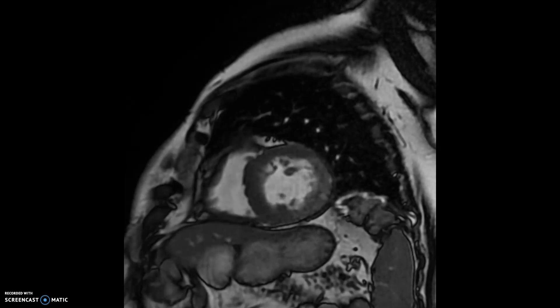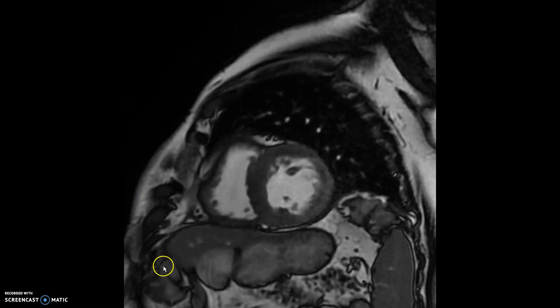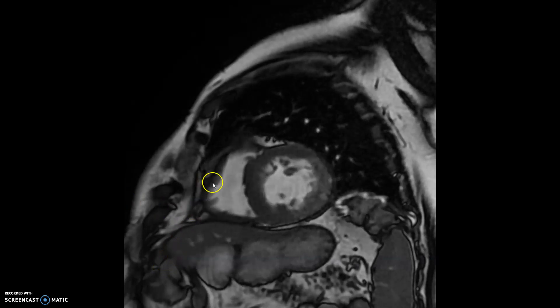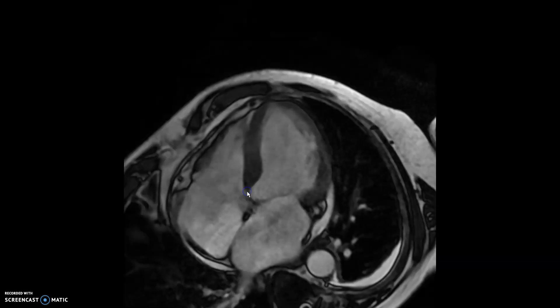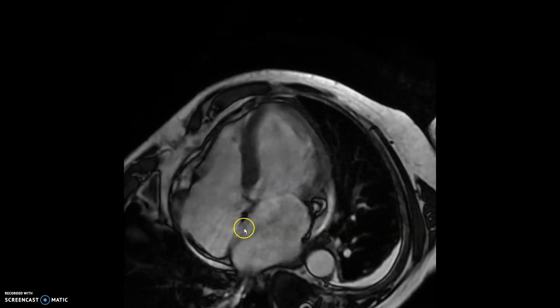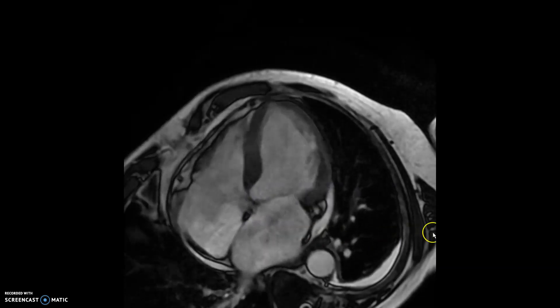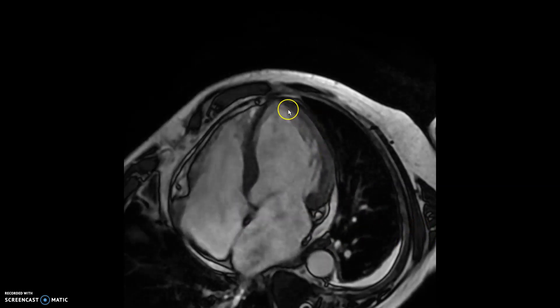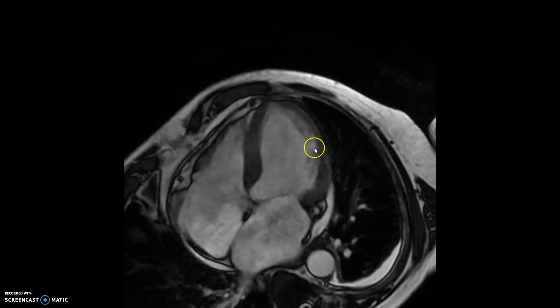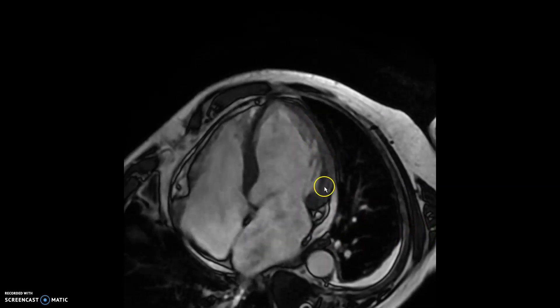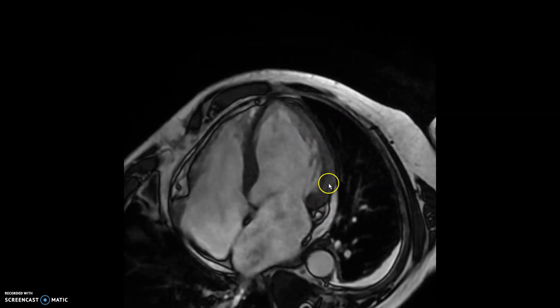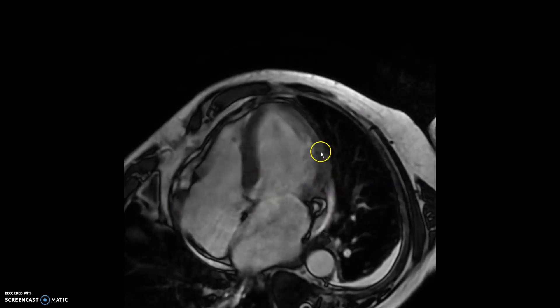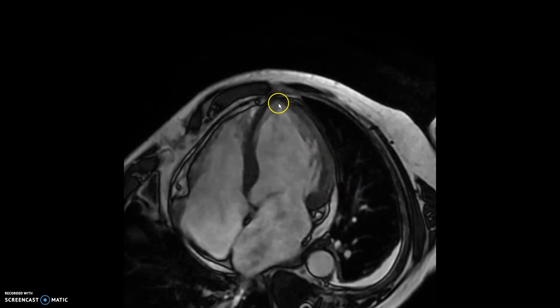However, because of his fevers and there was a concern that there's more wall motion abnormality than the vessel involvement, this MRI was ordered. As you can see, it continues to have this anterolateral wall motion abnormality. The bases are contracting much better than the mid and the apex.